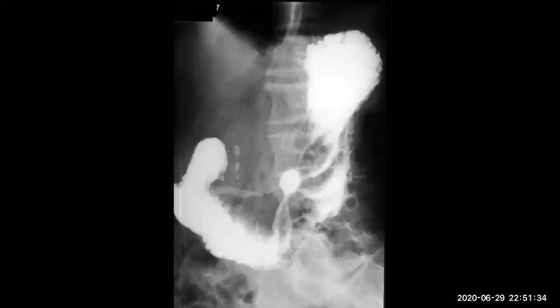Is there anything else? Hampton line. Do you see the Hampton line? I see a little lucency. This is en face. If you look here, this is the wall, and you can appreciate a minimal crater beyond the lesser curvature. Yes. And there is mucosal fold thickening. You see here it is thick.